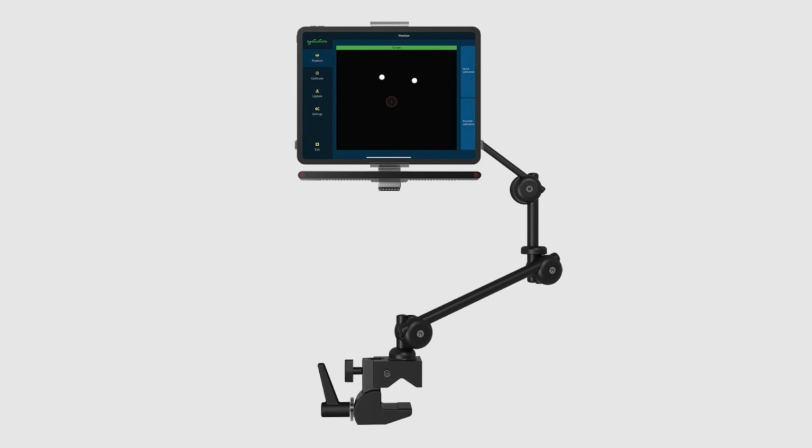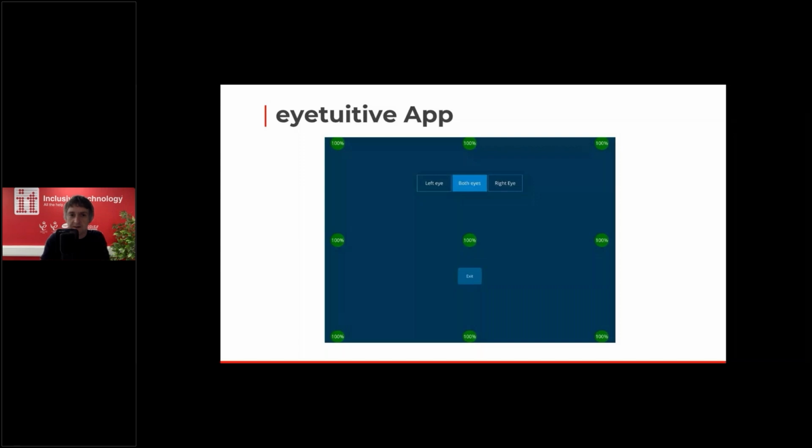You can see the clamp on the bottom there, so you can attach it to a wheelchair or desktop, and that's supplied in a 3 tube solution, because you need the depth, of course. You can't have it so close. You need a depth of at least 50 centimeters between the user and the device in order for it to work. So that's the setup of the device there.